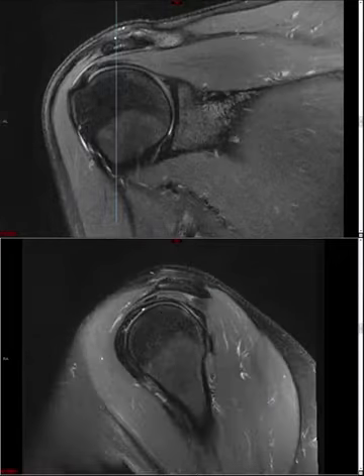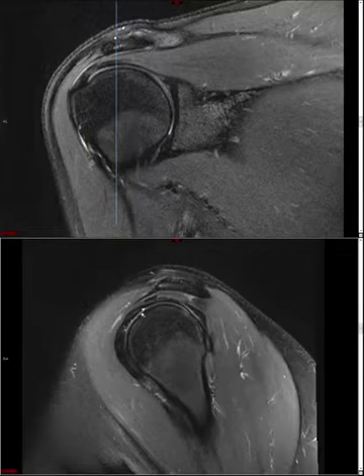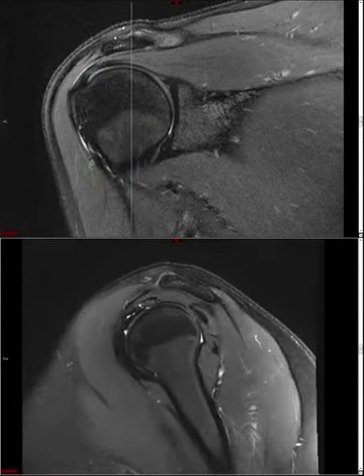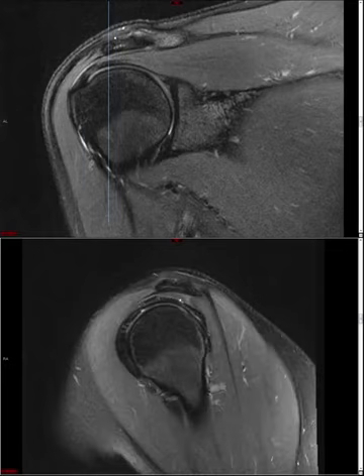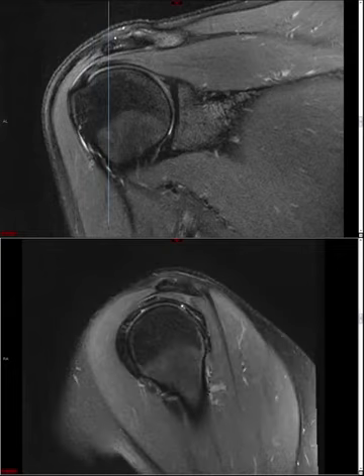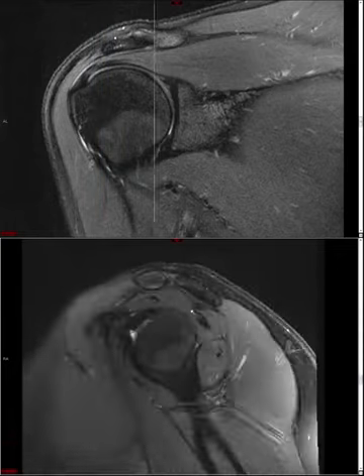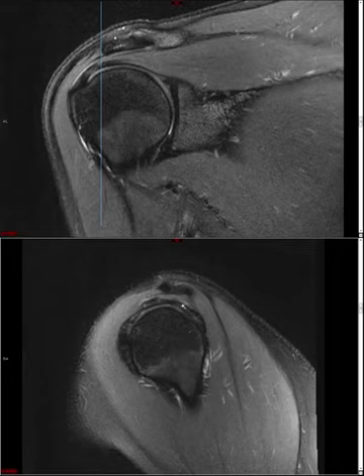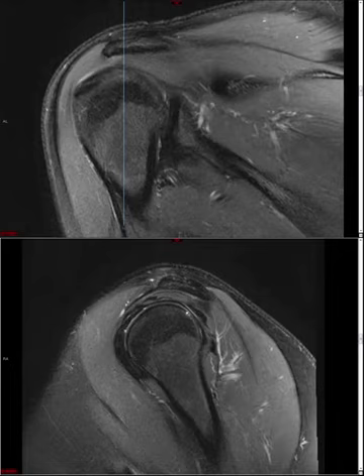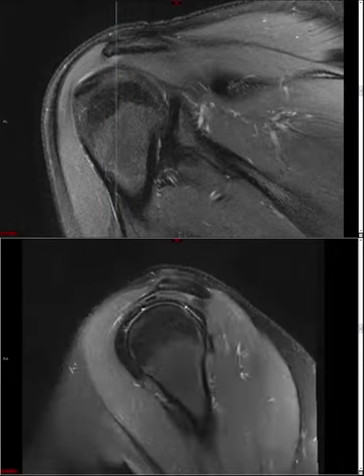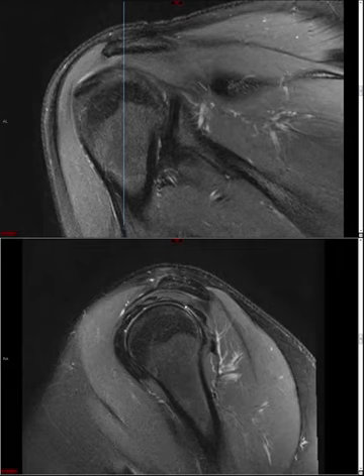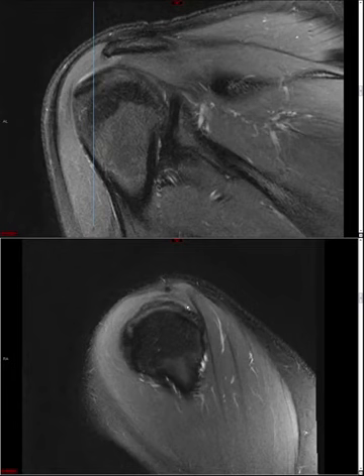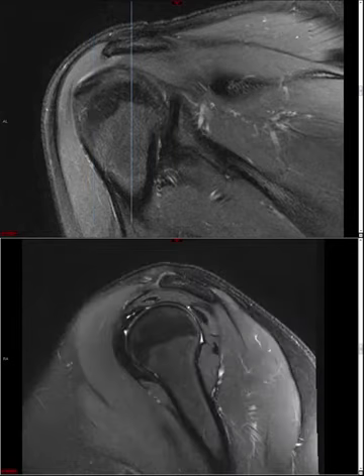Sometimes you'll see a tear involving the posterior fibers of supraspinatus. People talk about tears involving the anterior leading edge, mid fibers, or posterior fibers. It gets hard to tell if you're dealing with a tear in supraspinatus or infraspinatus. Anatomically, at the supraspinatus-infraspinatus interval, the fibers criss-cross. I don't spend too much time fussing about which tendon it is near this junction — I just say there's a rotator cuff tear at the supraspinatus-infraspinatus interval.